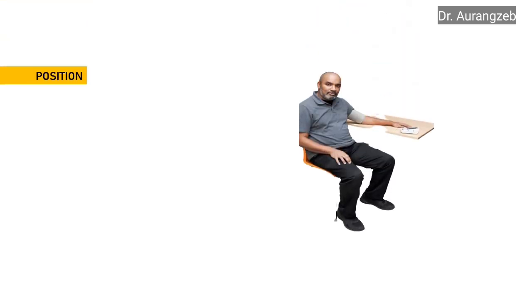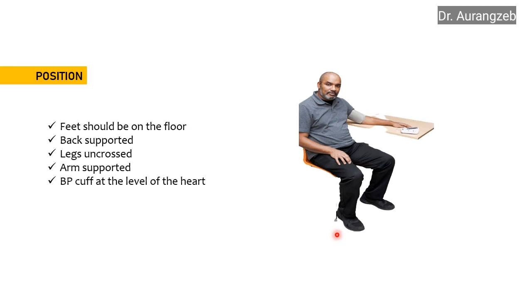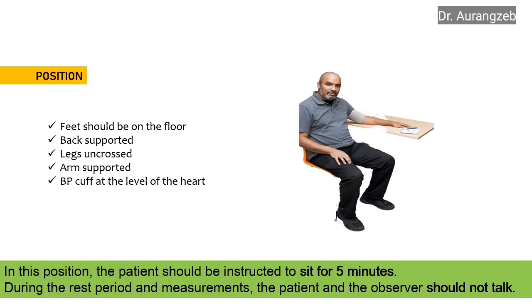This is the position of the patient. The checklist is: feet should be on the floor, back well supported, legs uncrossed, arms supported, and BP cuff at the level of the heart. In this position, the patient should be instructed to sit for 5 minutes.